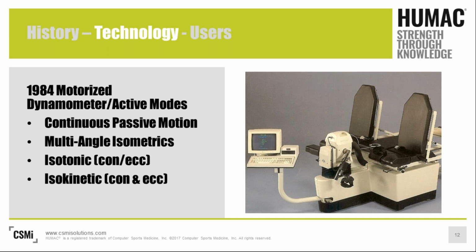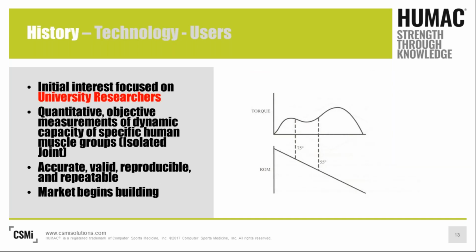So again, most of the research on isokinetics was really performed on passive machines, only measuring the concentric mode of contraction. If we really look at latest research or evidence-based research, a lot of it's coming out of Europe and even China, because they're looking at different components than what we have looked at in the past, and rightly so.